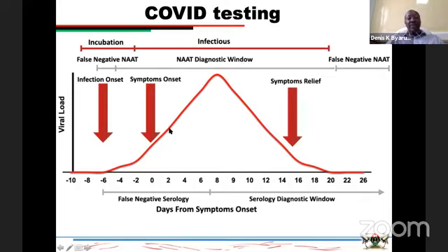But as the virus replicates and you have many viral particles, and therefore a higher viral load, you have the most efficient detection using your nucleic acid detection kits. And in the later stages, when the body has reacted and produced antibodies or some other immune responses, then you're comfortable using serological diagnostic tests. So the interpretation of these results is very, very critical, based on your understanding of the disease and the expectation from whichever samples you have received, and at what stage these samples were taken.